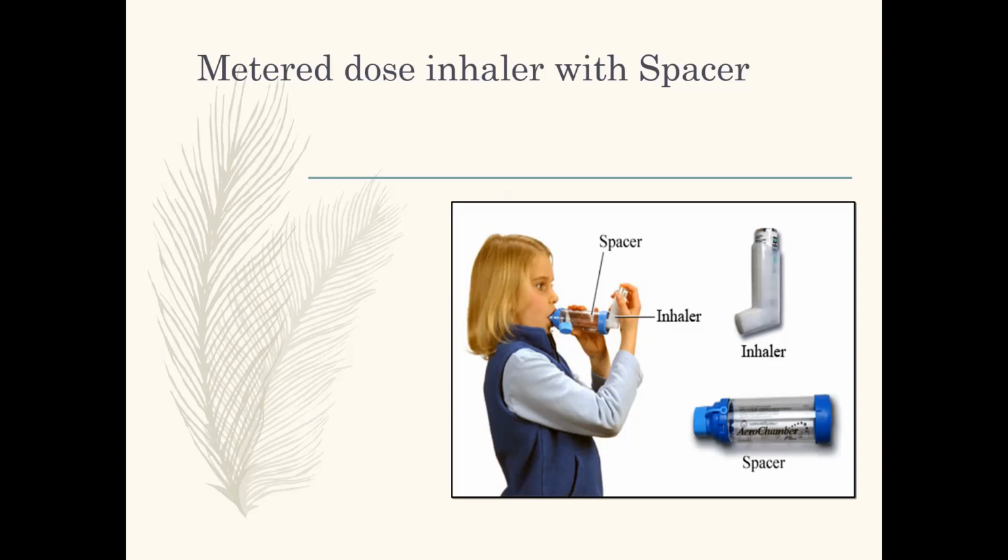The great thing about a spacer is it kind of harnesses all that medication in there. And if a client really has trouble utilizing their inhaler correctly, it helps them by having it concentrated right there to help them breathe that in again.